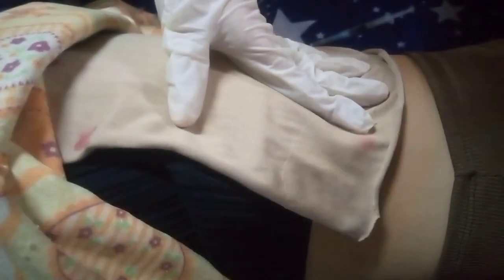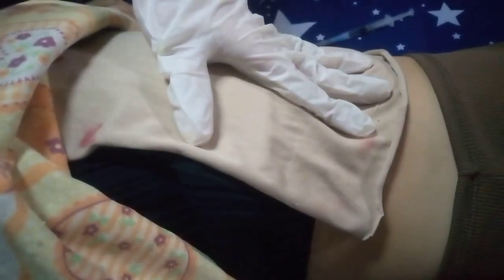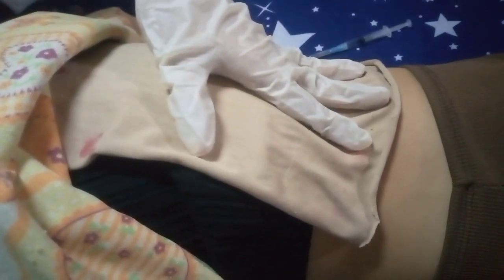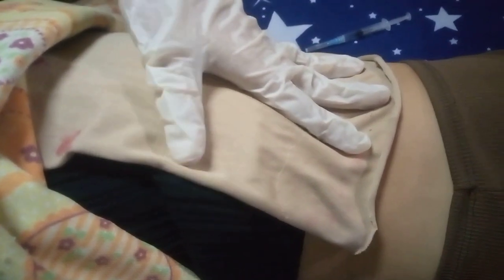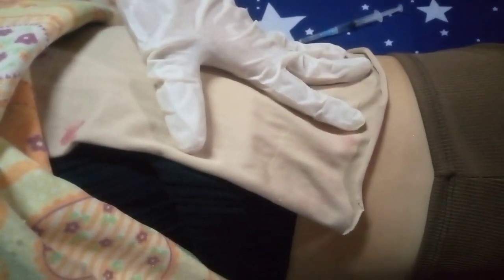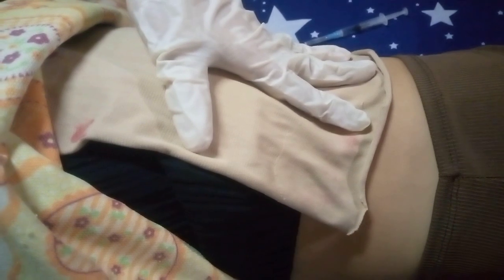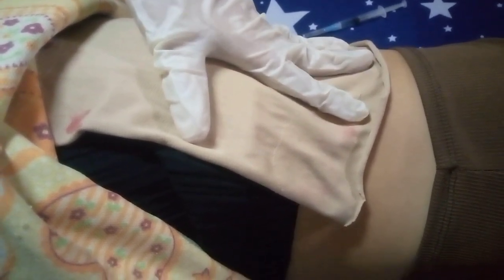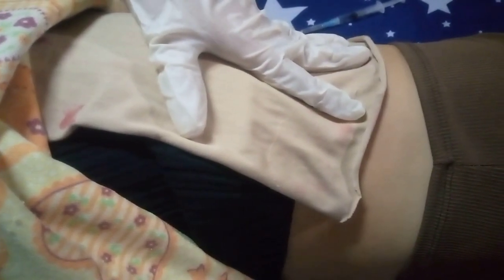For the ventrogluteal injection, place the heel of the hand over the greater trochanter of the patient's hip and with the wrist almost perpendicular to the femur, point the thumb toward the patient's groin, point the index finger to the anterior superior iliac spine, and spread the middle finger back along the iliac crest towards the buttocks.